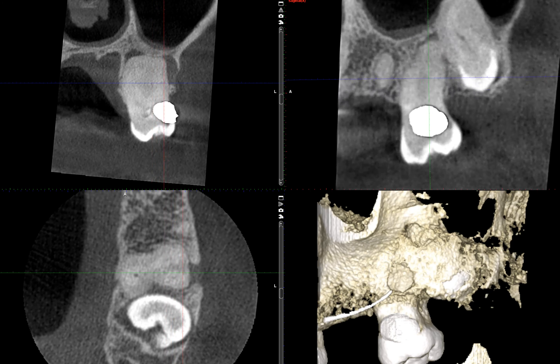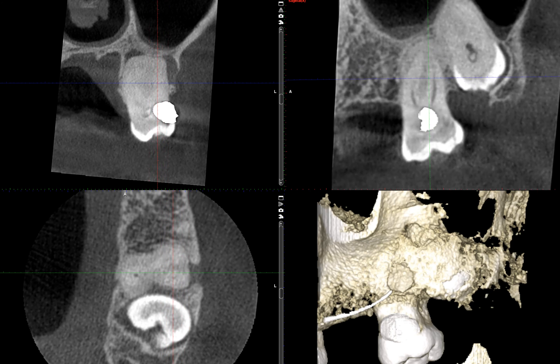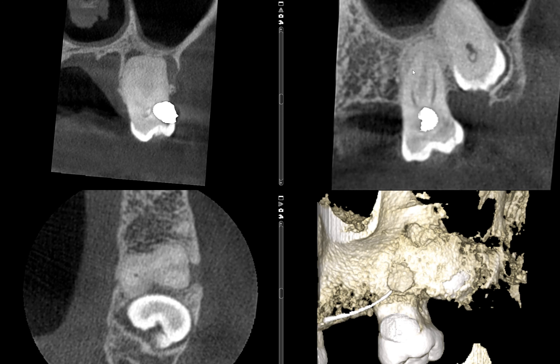As I scroll through, I want you to follow the PDL space as best as you can. I'm going to stop right here — I want you to see something very interesting. Here we can see perhaps the outline of the original root, but if you look carefully, there appears to be a radio opacity that's in contact with this root — perhaps grown, perhaps deposited. You can see there's a thin radiolucent ring, most likely representing a PDL space along this tooth.